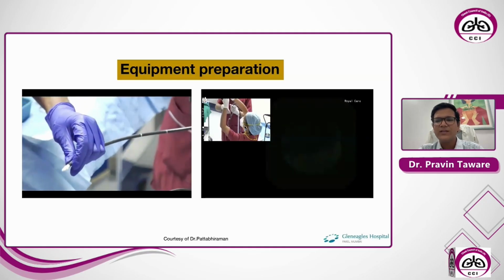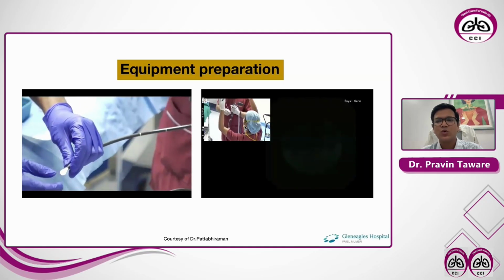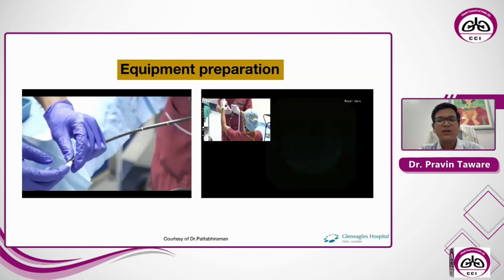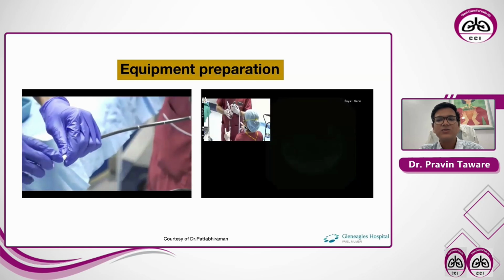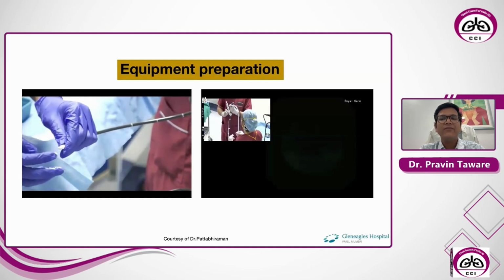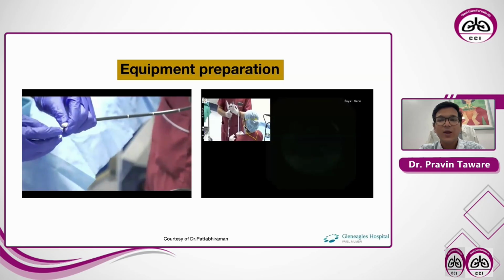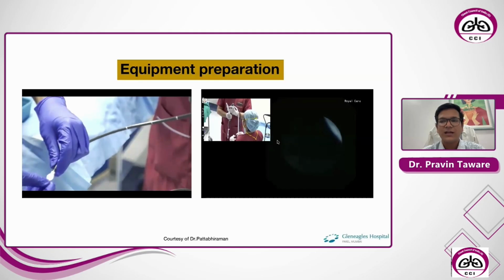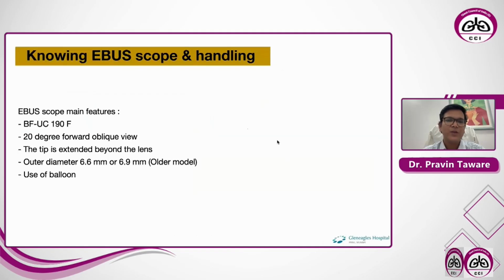And always do a needle preparation also before the procedure. Checking the needle is very important for your convenience and reduces the time during the procedure. Pre-measure the needle and fix it in order to see only the tip of the sheath at the 1 or 2 o'clock position, as you can see in the video.